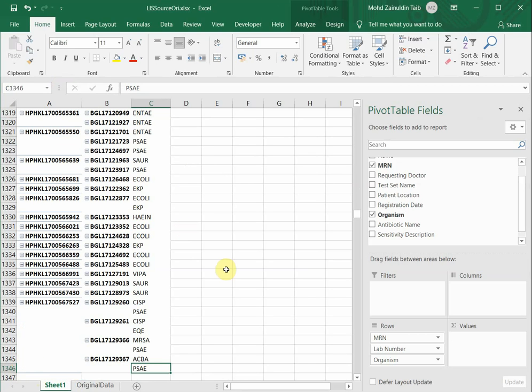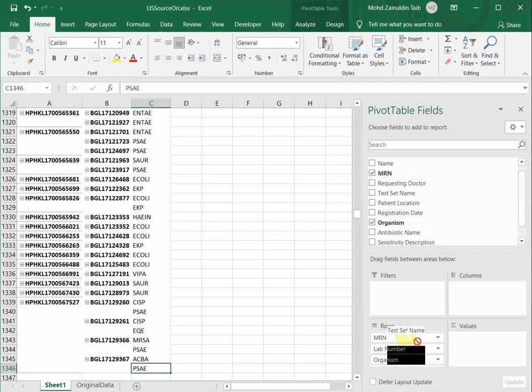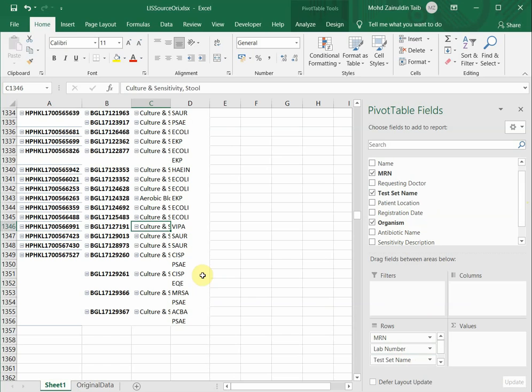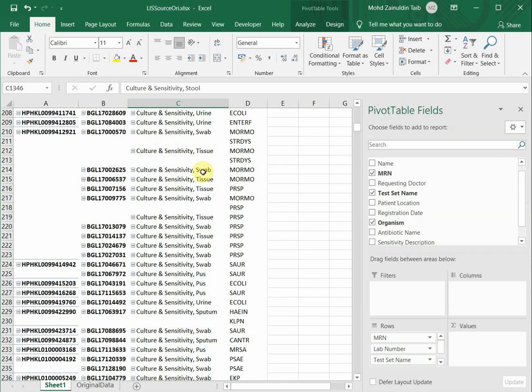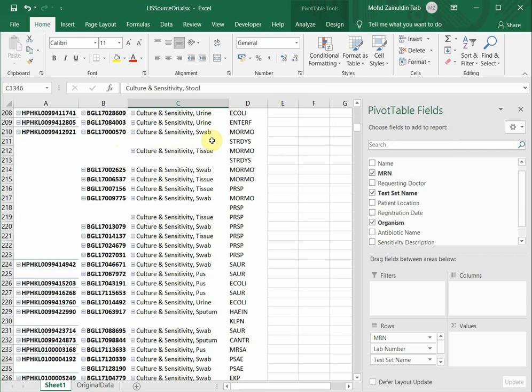But there's a special case in this. I realized that I have the same lab number for different specimens. If I put specimen here, specimen under test name, under lab number here, then we go again to the bottom, you can see there's 1,355 minus the title. You can see here there's a slightly different way of recording. For example, this is the same patient, and this is the lab number, but under the same lab number you have 2 specimens, swab and tissue. And again it happened here, the same lab number, but you have swab with 2 organisms and another tissue with 1 organism.